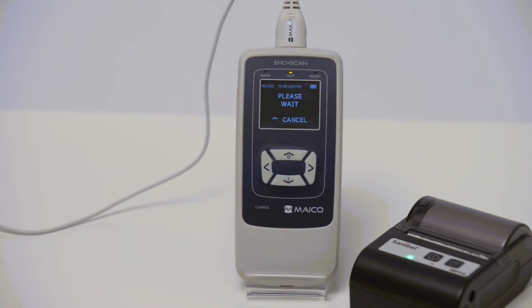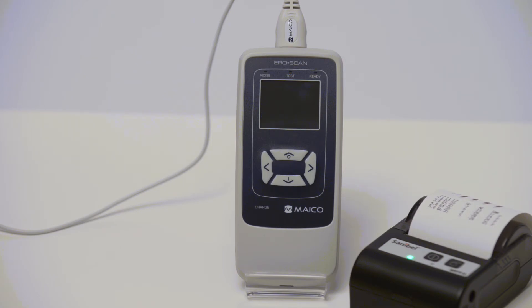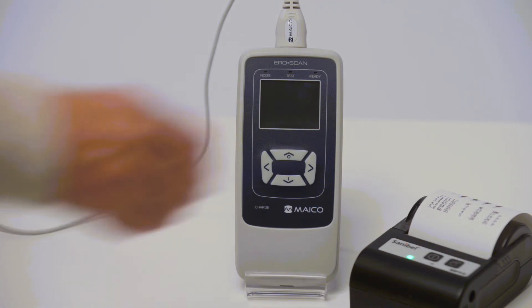Results can also be transferred to a computer using the included MAICO software. Once a print or transfer has been completed, the stored measurements will be cleared with the start of the next test.